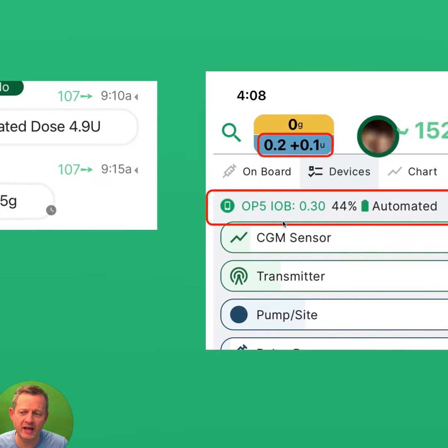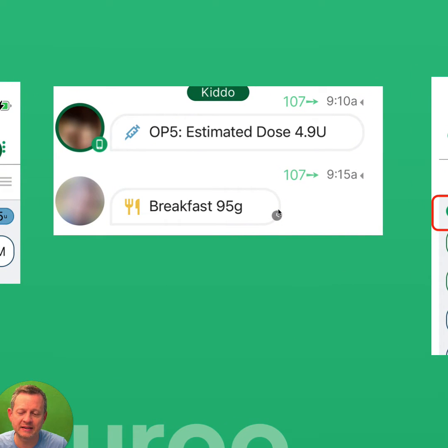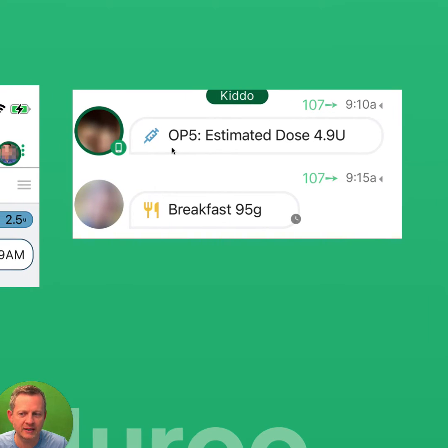When you do a bolus on that device, you'll start seeing things like this message come automatically. You'll still have to enter the carbs directly — there's no synchronization of carbs in this integration at this time. But the boluses and the insulin on board will be tracked automatically and approximately.